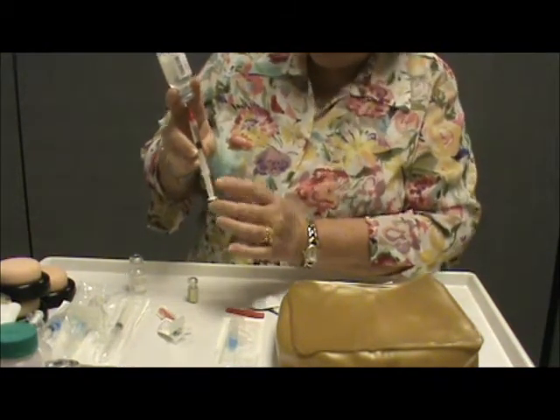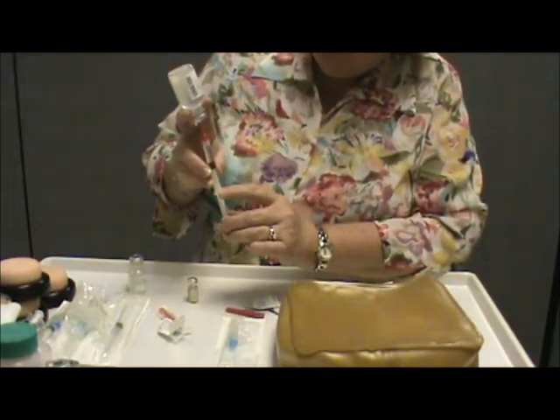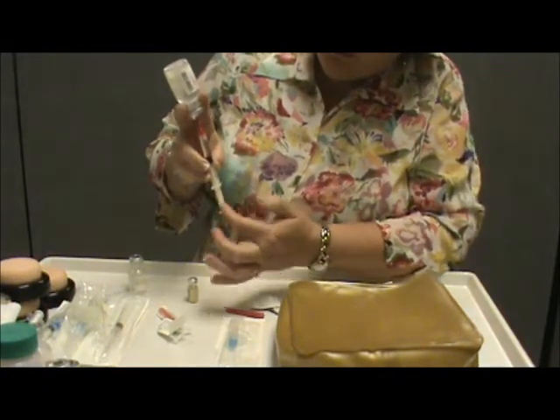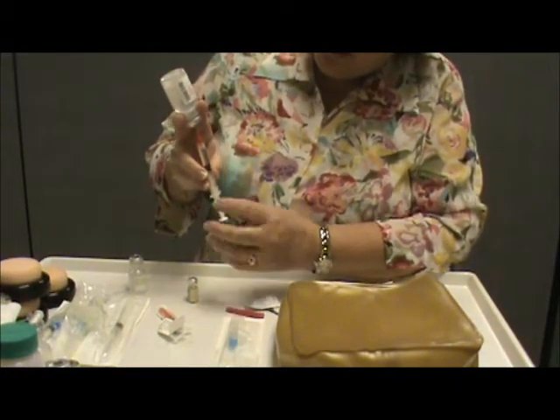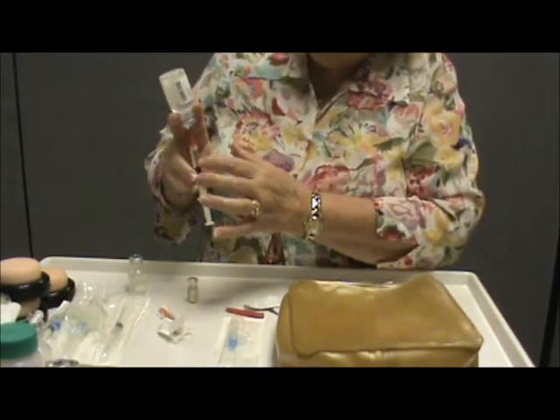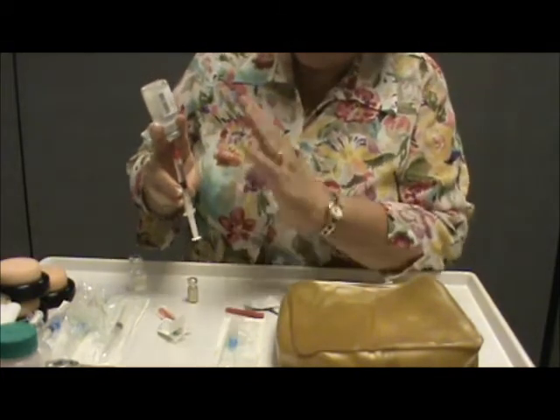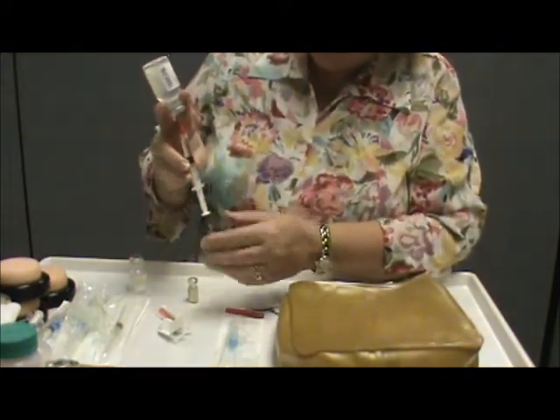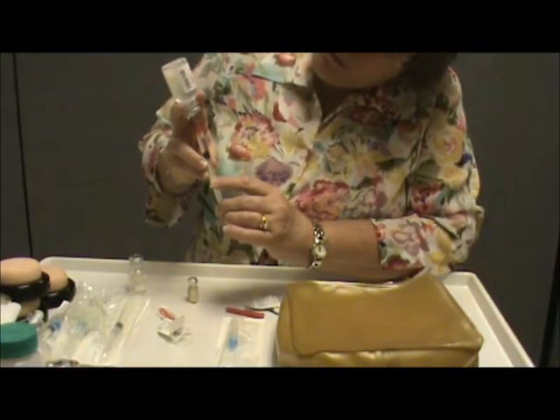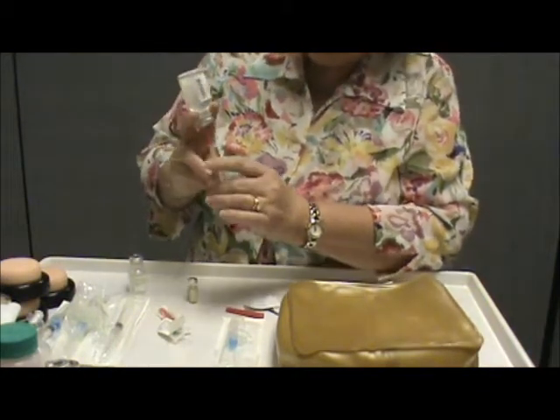We do want to avoid touching the piston of the syringe here, and the reason being is if I touch it, I pull way down, and then I touch it, and then I inject, I'm going to be contaminating my fluid area, and so then I've contaminated everything. So while you're drawing up your med, you want to avoid touching it. I'll push it back up here and get my dose exactly.